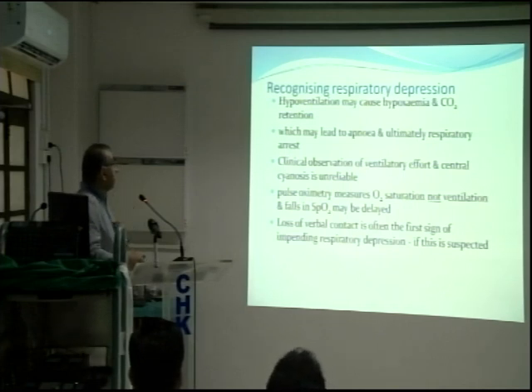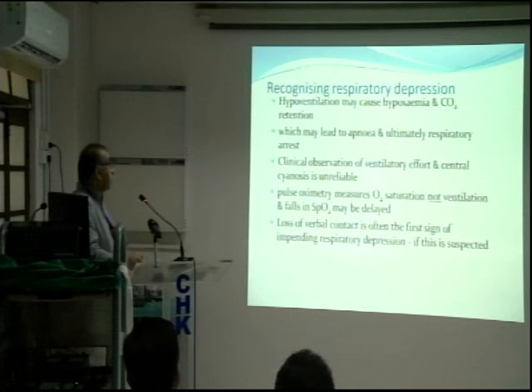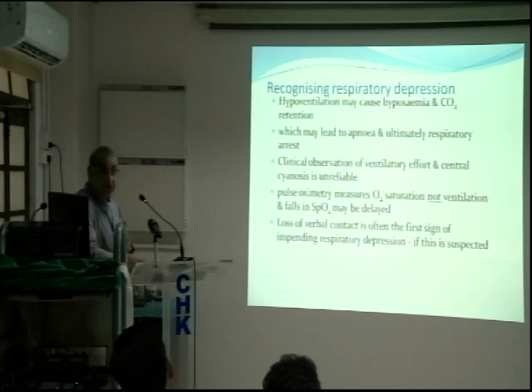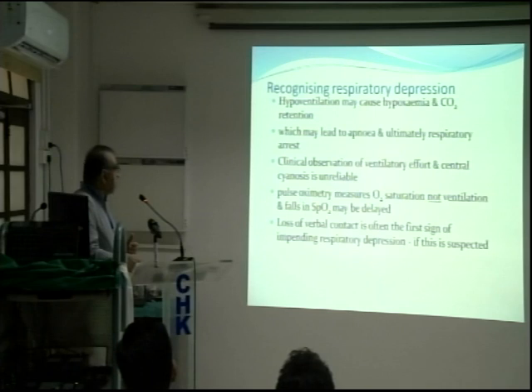Recognizing respiratory depression: hypoventilation may cause hypoxemia and CO2 retention, which may lead to apnea and ultimately respiratory arrest. Clinical observation is most important, because the important thing is loss of contact with the patient. The moment that occurs, you act, because if you wait for cyanosis, it is too late, right? So always, pulse oximetry again is important.